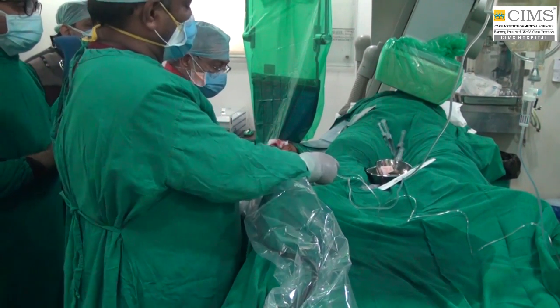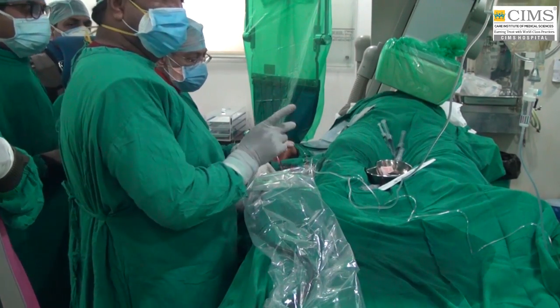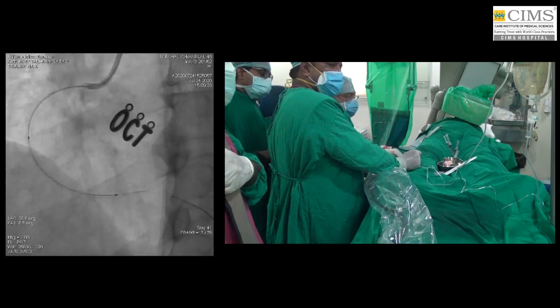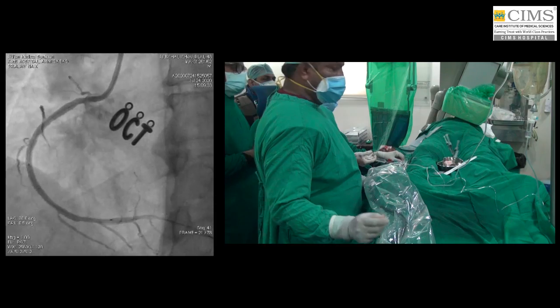The same precautions every time we have to take in the OCT. It is very, very important that there should not be any blood in the syringe, because we will not get good OCT images. So the same precaution should be taken every time we do an OCT.